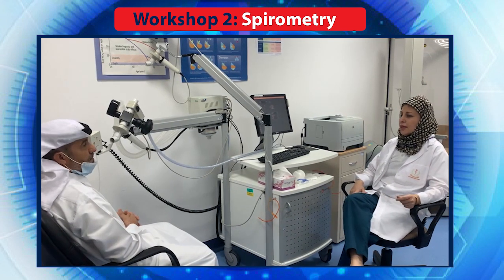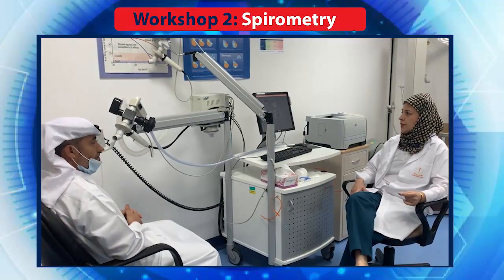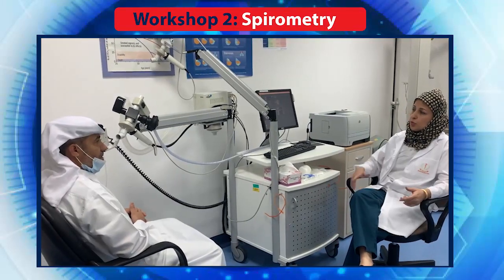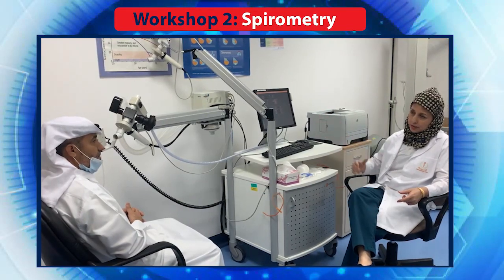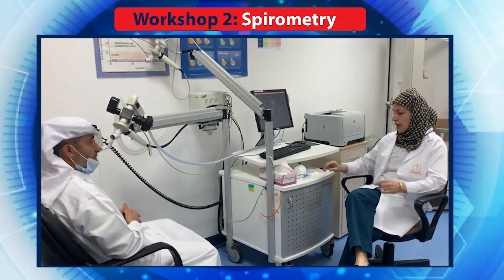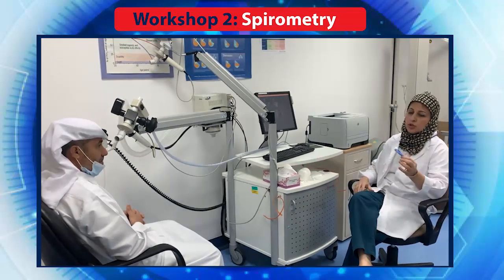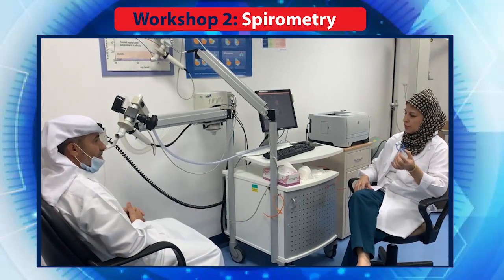Assalamu alaikum. My name is Zarina. I would like to do a breathing test for you today, which is called spirometry. So you will be blowing into this machine, and it will measure how well you are blowing out. Okay, this machine. And I will ask you to block your nose, so you are breathing only through your mouth, okay, not through your nose.